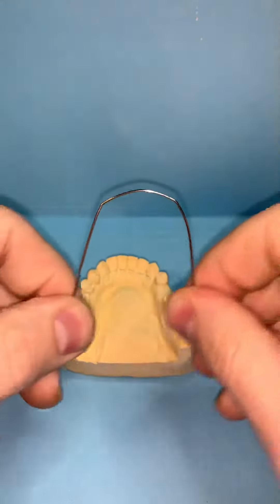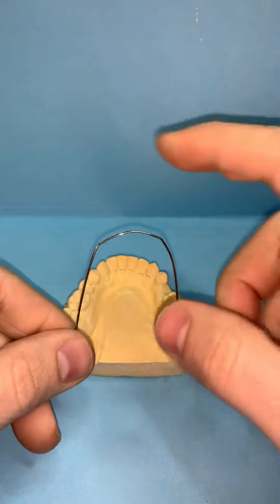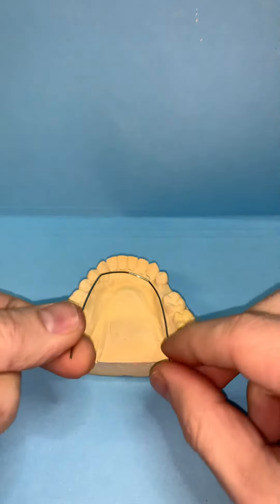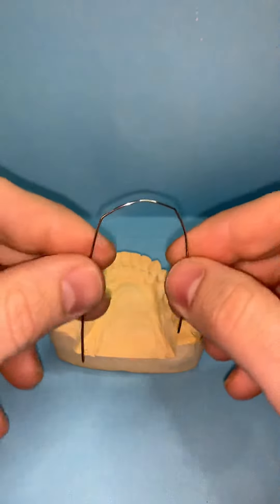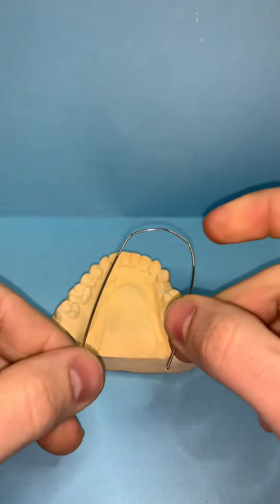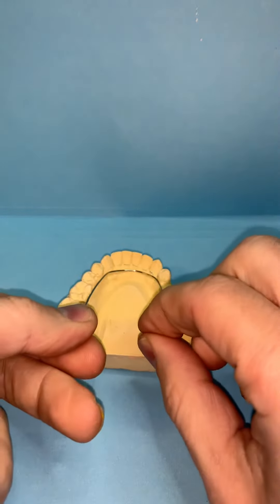So now you have your wire almost with two little squares. Once again, make sure it's smaller than the arch because you don't want it to put any pressure on the teeth.